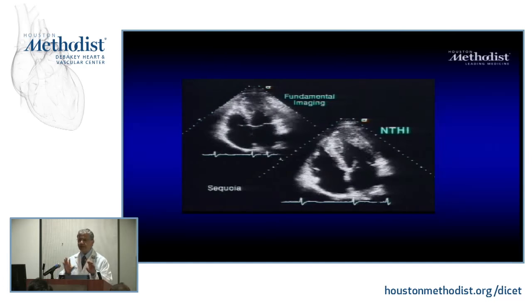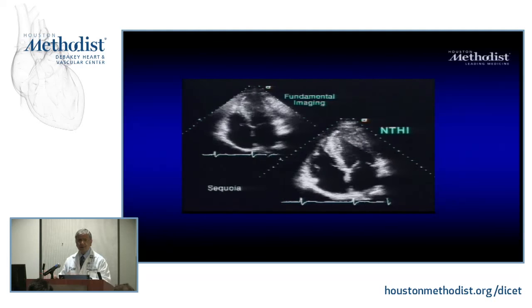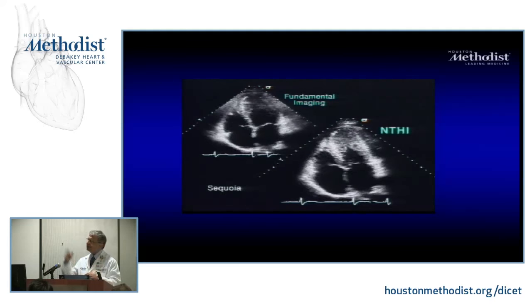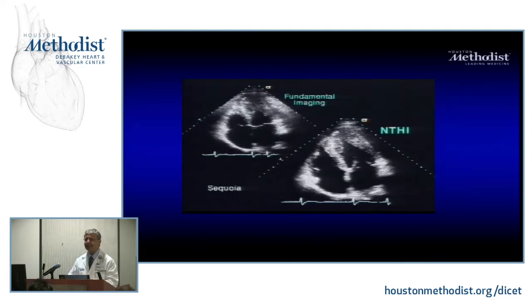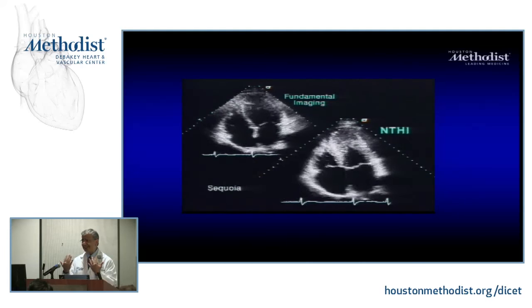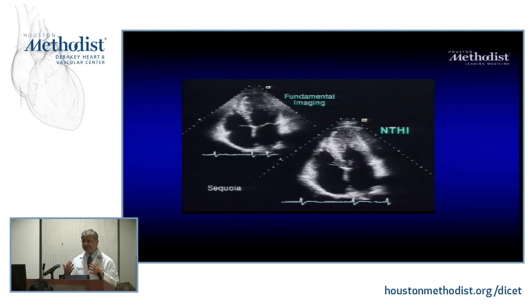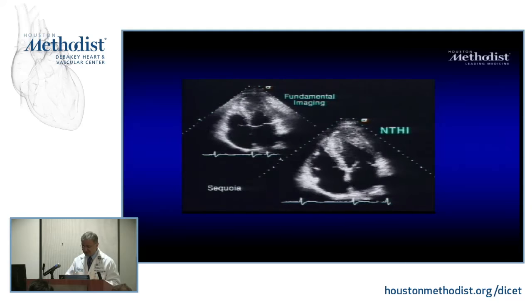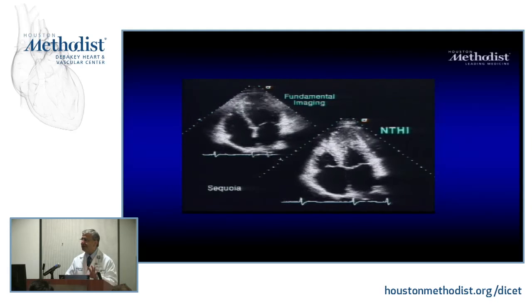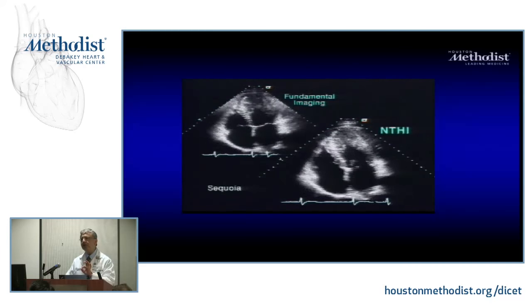Okay, and I know fellows love to give pathology to patients. Wherever there's calcium, I'm going to slap a calcium on it. Wherever there's thickening, I'm going to slap some thickening. All right? So decrease the thickening portion, okay? Just be gentle. I'm not saying omit things, but don't feel good just labeling pathology. So keep that in mind, because the structures may look thicker.